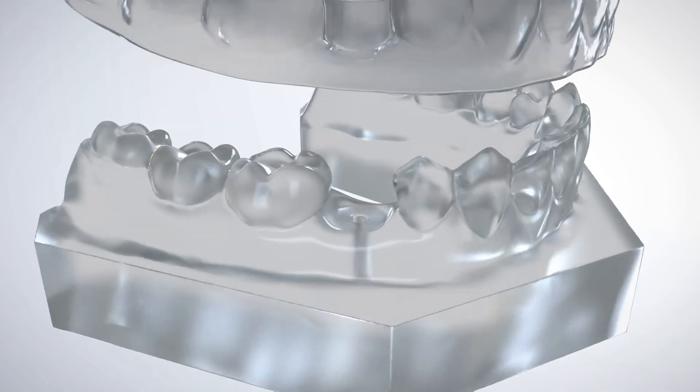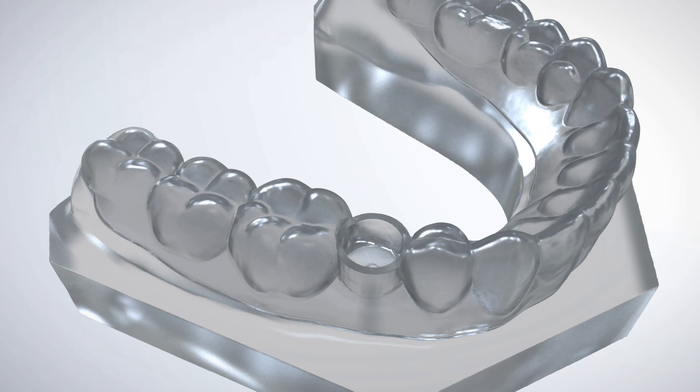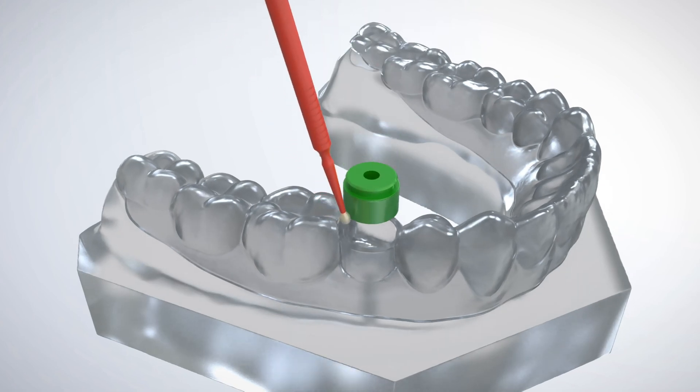A surgical guide created with implant planning software incorporates a cylinder diameter designed to receive the GRS surgical ring. The virtual surgical guide is then 3D printed or milled. A light curable medical grade adhesive is placed around the inside of the surgical guide cylinder and outside the GRS surgical ring.